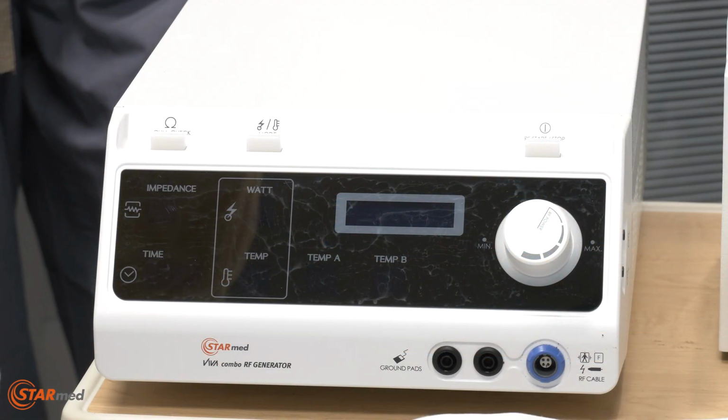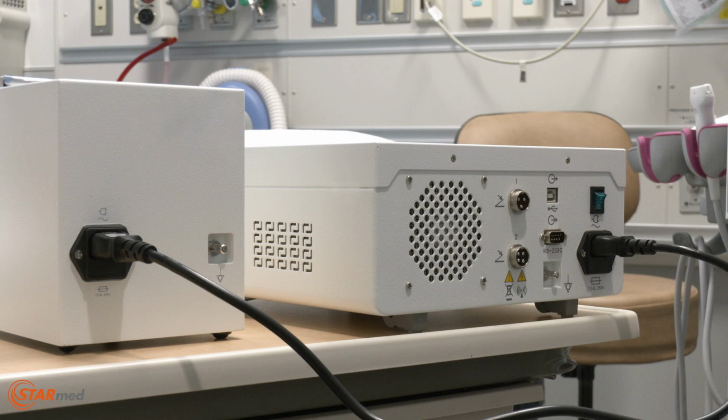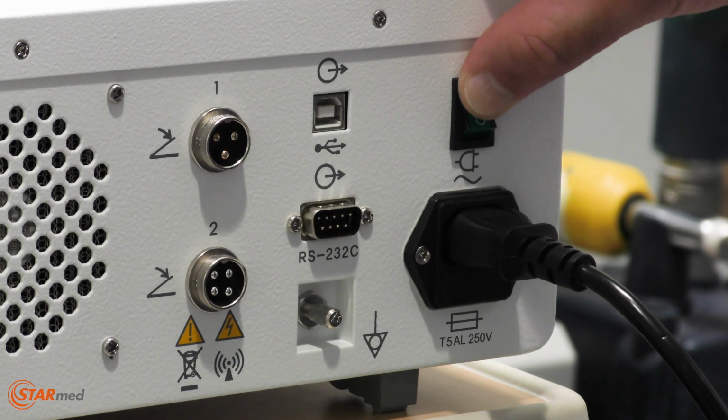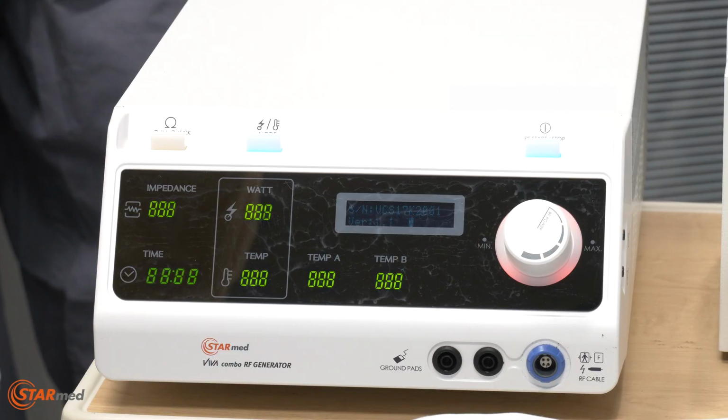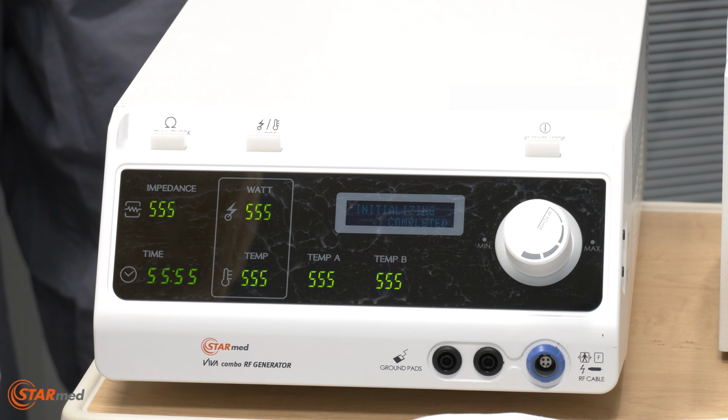Let's begin our setup with the generator. First, make sure that nothing is plugged into the connectors on the front of the generator. Plug in the power cables and then press the power button on the back. The generator will briefly run a self-test before being ready for use.